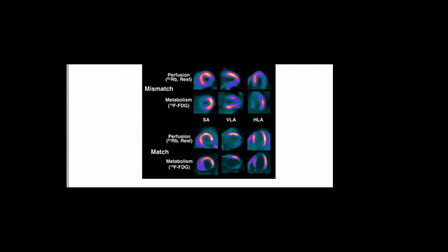Now the one above, the defect is not fixed during rest.